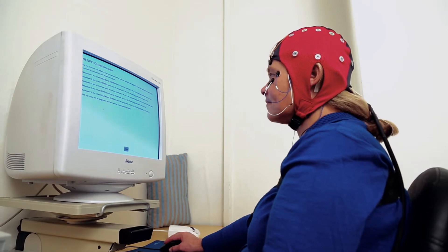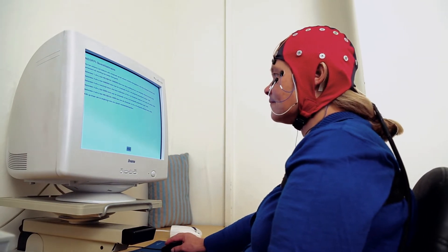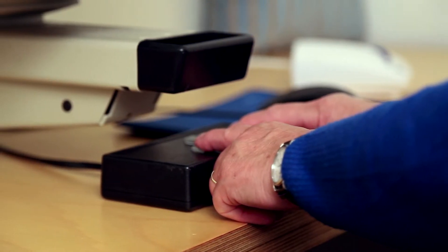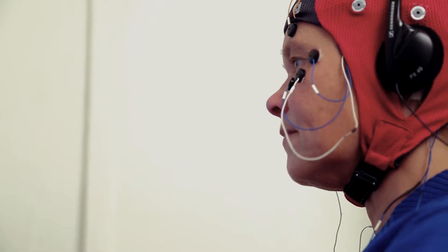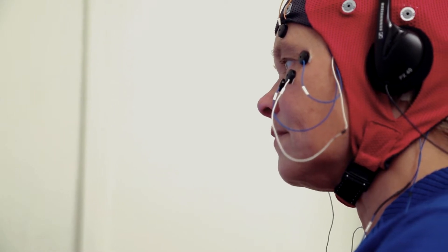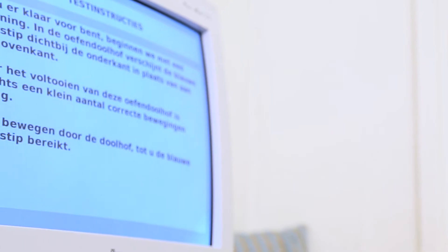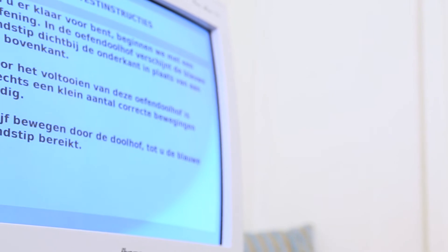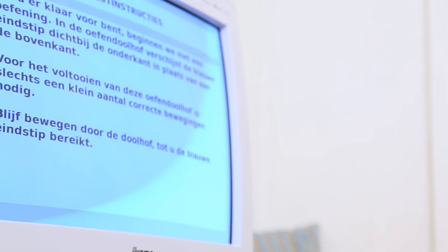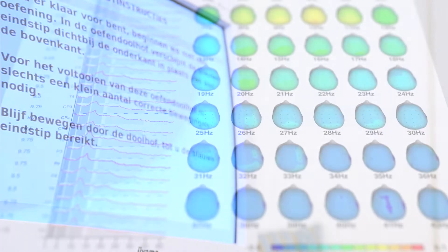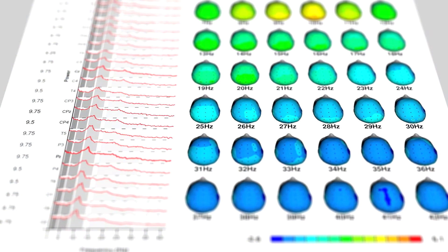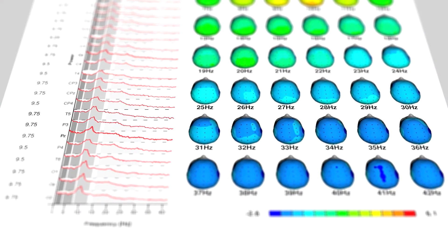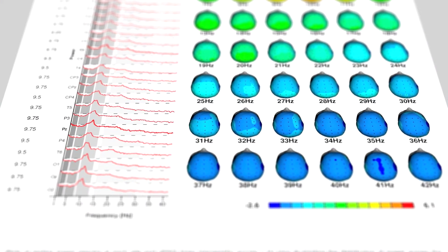The EEG, or electroencephalogram, is an assessment of brain activity. During the QEEG — quantitative EEG — the client performs a number of tests. The brain activity obtained and the results of these tests will be compared with previous QEEG assessments from people of the same age and gender.